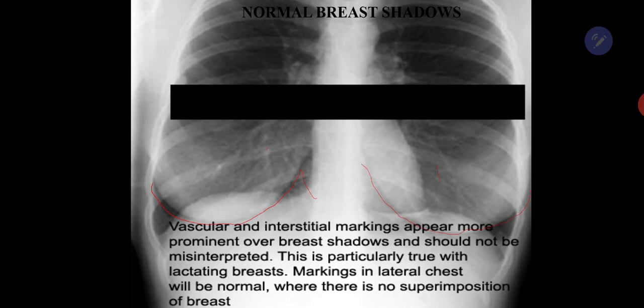And to just confirm, if you take a lateral chest x-ray, the markings will be normal because there is no superimposition of the breast on lateral imaging.